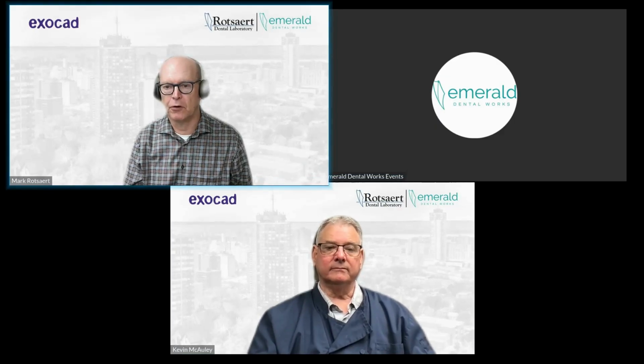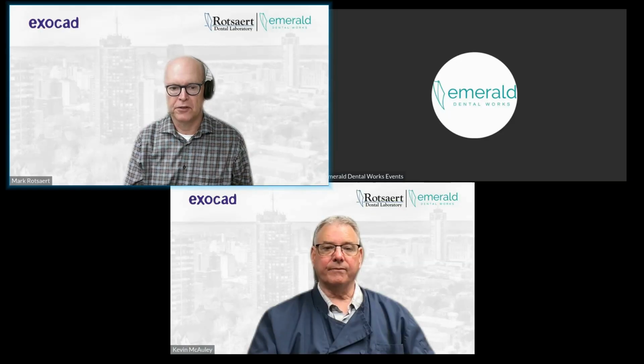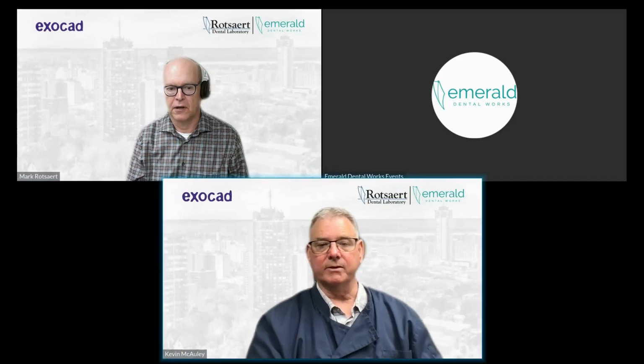Okay. So what's the turnaround time to receive a plan once you have all that information from the doctor's office? Good question. We need to get everything in our hands, grab all the photos, and bring everything together. We look for a minimum of 3 days before we'll get you a plan. Obviously, we'll accommodate something quicker just so you have a good turnaround time.